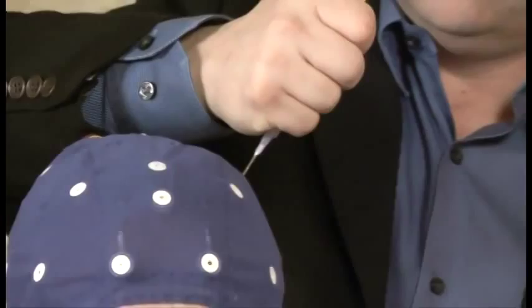After you've worked through all the sensors and gel in, it's good to intermittently come back and retouch up the connection at the ground. Once you have all green dots on the screen at each location, that tells you you have excellent connectivity or impedance to continue the test. These locations at the temple and forehead are sensitive. Be very gentle with these locations.